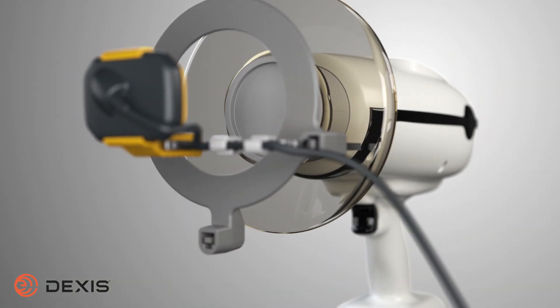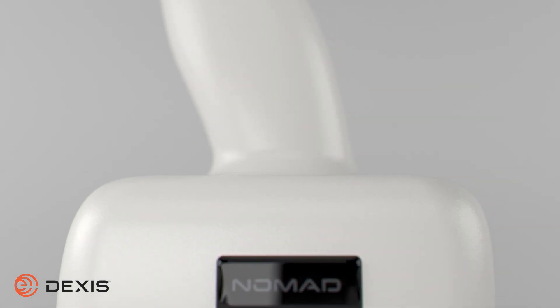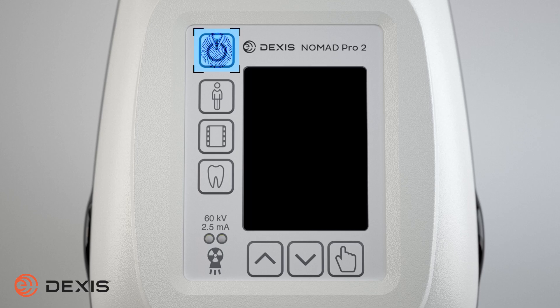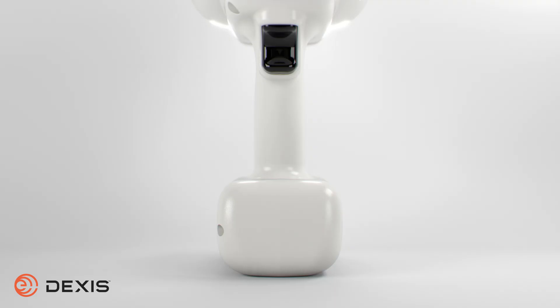This ensures you stay within the protective zone. In between exposures, you can either set the Nomad down or cradle the device in one arm. Cradling allows you to safely use your hands while positioning, without having to put the Nomad down. To power off the Nomad, press and hold the power button, or simply wait and the Nomad will automatically turn off after approximately 3 minutes of inactivity.